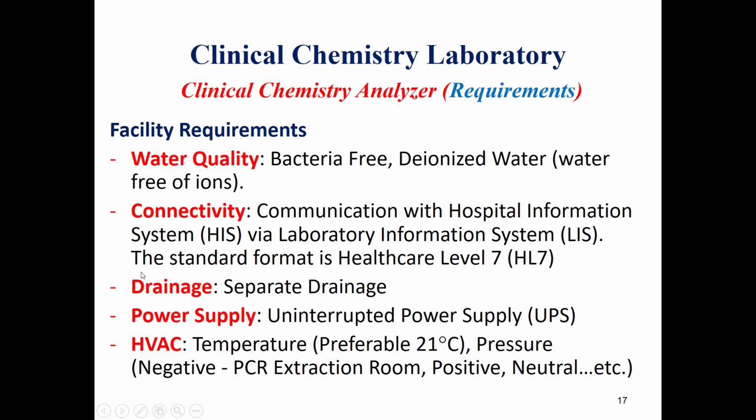Another requirement will be a separate drainage. Also an uninterruptible power supply, or UPS, will be needed. Also a certain temperature, humidity, and atmospheric pressure are needed.